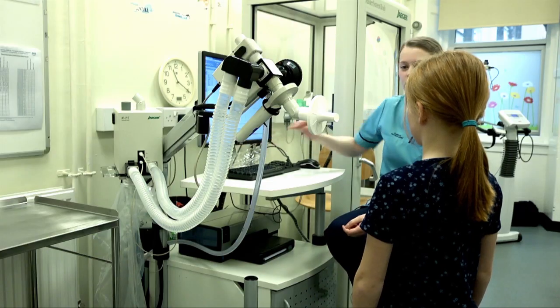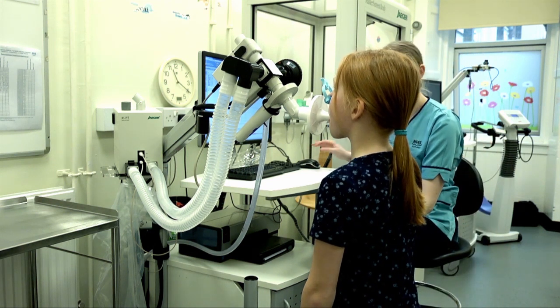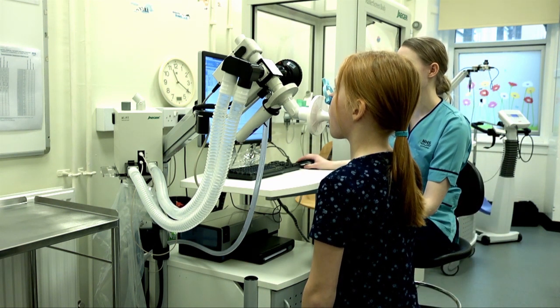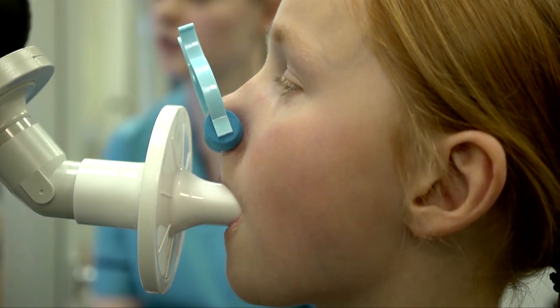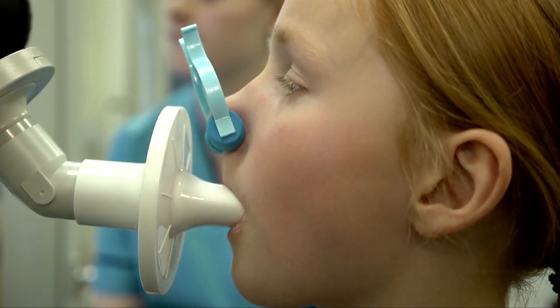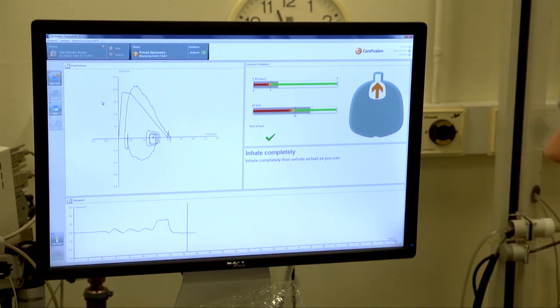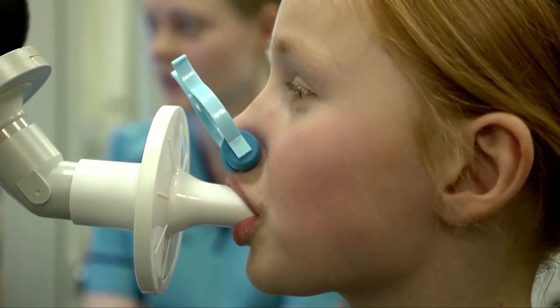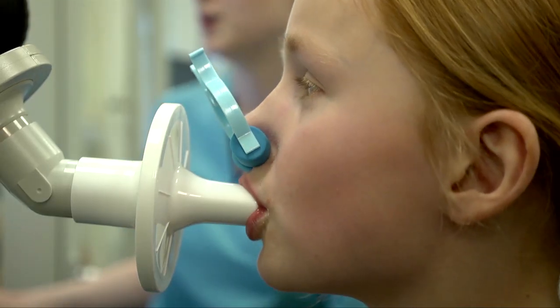Shall we give it a go? Yes. If you want to put your lips and teeth around the mouthpiece now — that's it, close your lips around. Perfect. Just start with nice normal breathing, in and out normally for me. That's really good. Well done. Now take that big breath all the way in and blast out all the way as long as you can. Keep going, keep going, keep going, and a big breath all the way in again and then come off and have a rest.